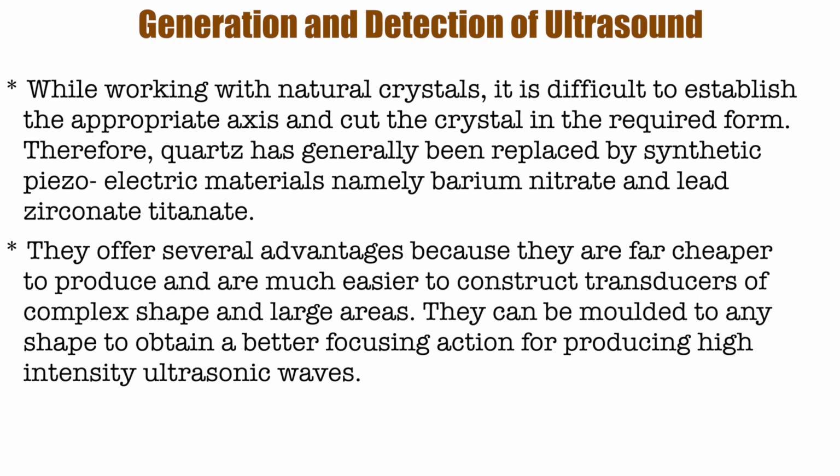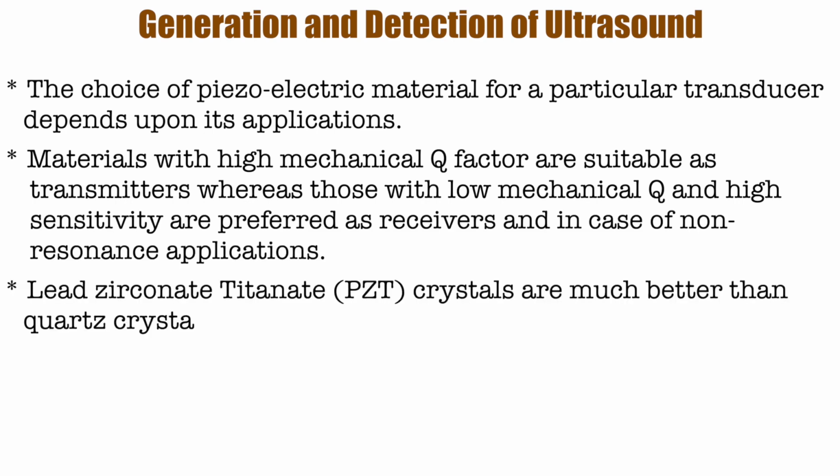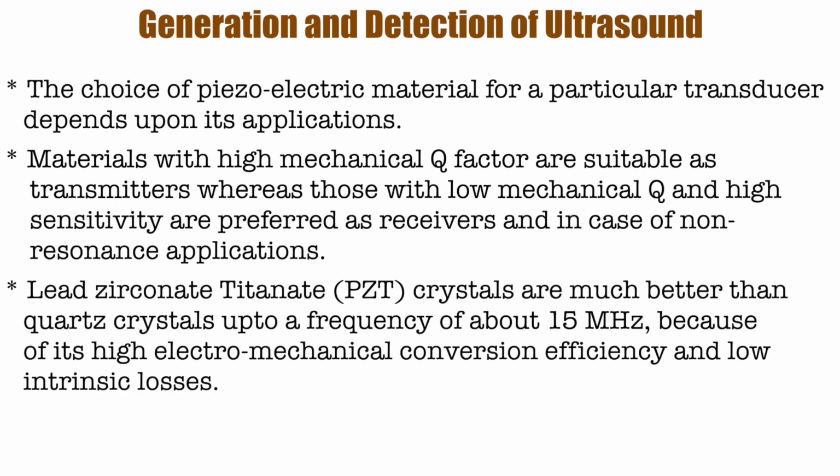They can be molded to any shape to obtain a better focusing action for producing high intensity ultrasonic waves. The choice of piezoelectric material for a particular transducer depends upon its applications. Materials with high mechanical Q factor are suitable as transmitters, whereas those with low mechanical Q and high sensitivity are preferred as receivers, and in case of non-resonance applications.